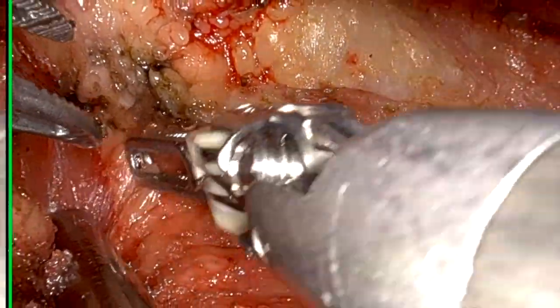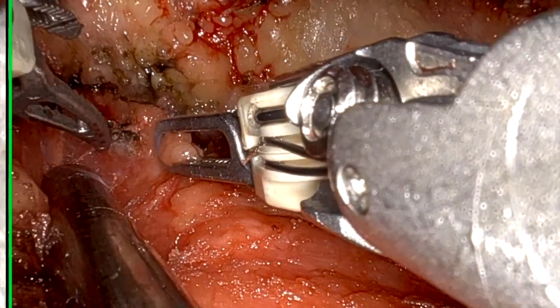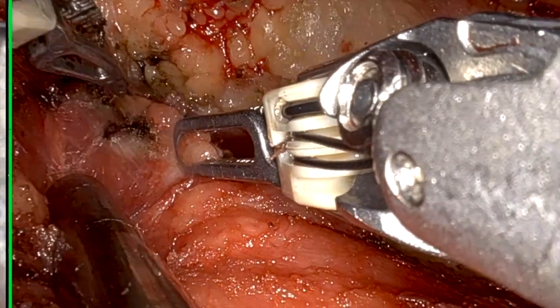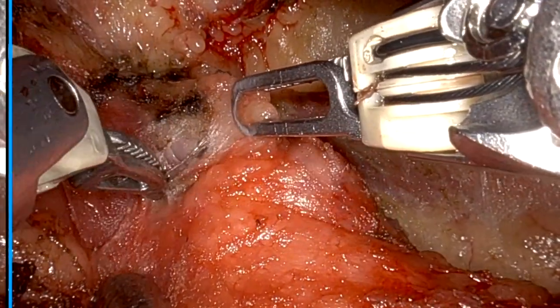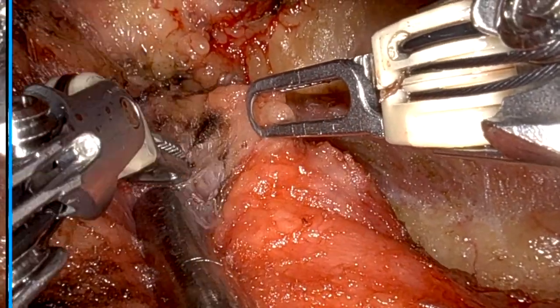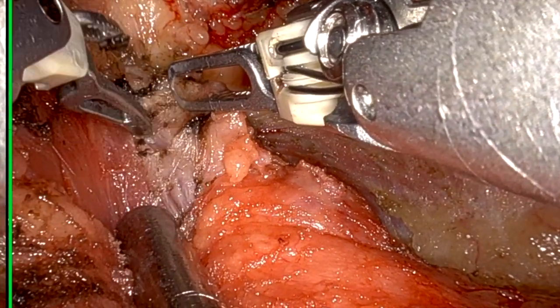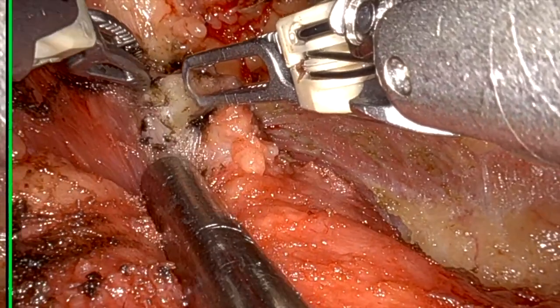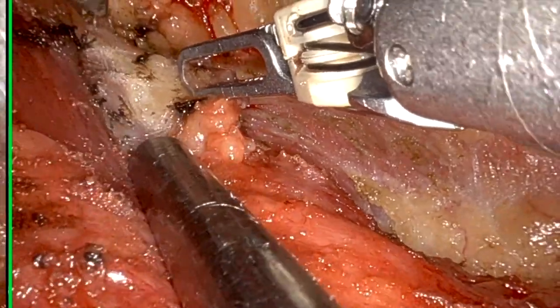Hold level 1A with fenestrated bipolar and I started my dissection. Few do's and don'ts about 1A. Don't leave any tissue behind at apex of 1A. This is most vulnerable area. Second thing, in most of the cases you will get a vessel at apex of level 1A. Buzz it and then proceed if you want your field to be clean. Third thing, don't forget to tie or clip anterior jugular vein. At times it may cause bleeding and this can be the reason of re-exploration. So don't forget about anterior jugular vein.